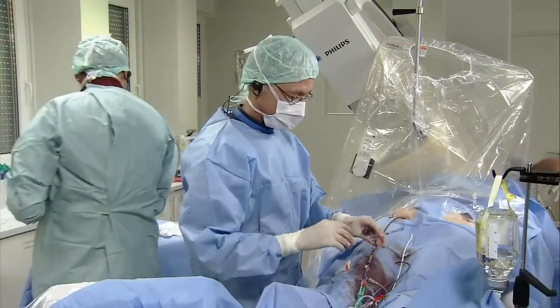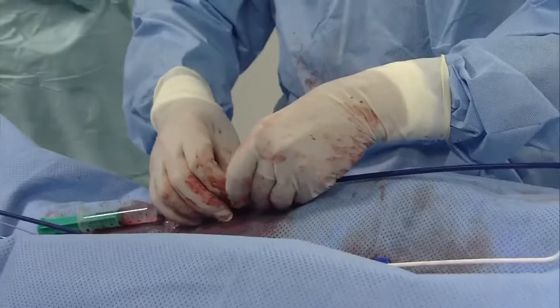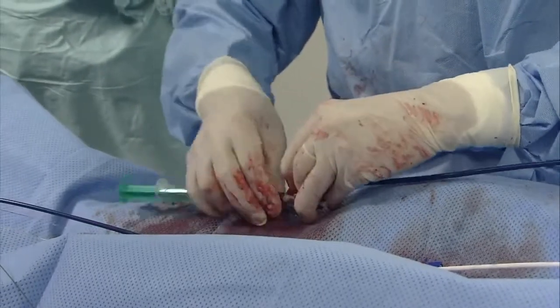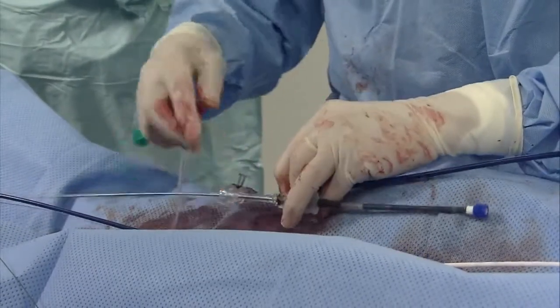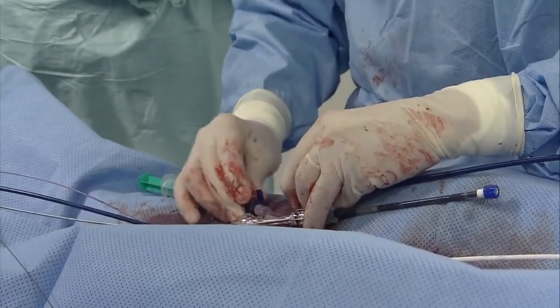With these images, haven't we found that there is now a small landing zone to tether something in? It's looking a better bet now than it was before. So I think the angio and echo do match now. I think we are in the superior lobe, and now we've got a landing zone, hopefully, in that lobe.